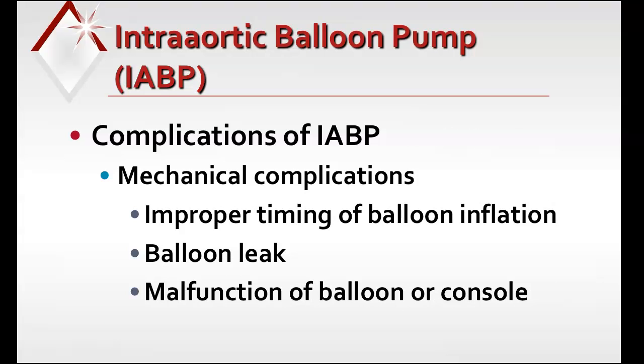All right, mechanical complications are very, very rare, but they can occur. So you can have improper timing of the balloon inflation, which can cause increased afterload, decreased cardiac output, myocardial ischemia, and even increased myocardial oxygen demand. It's really important that these complications are recognized immediately and we report them to the healthcare provider as soon as we assume that something is going wrong.